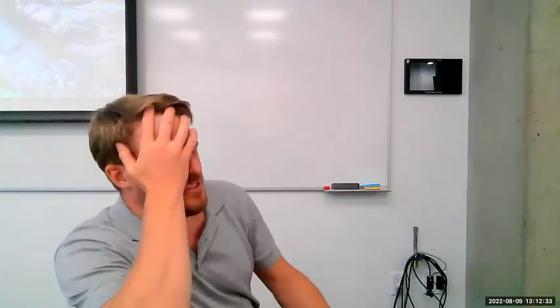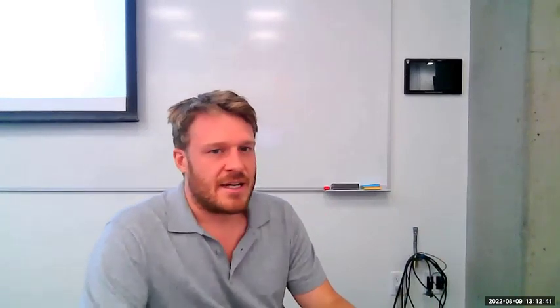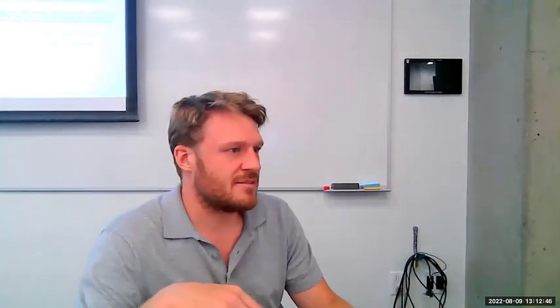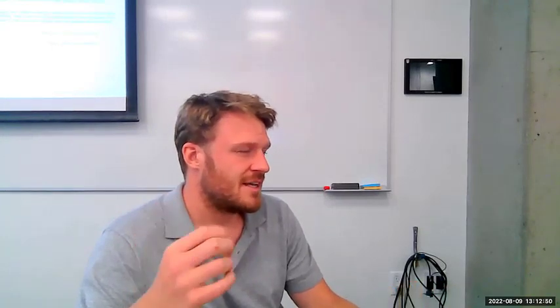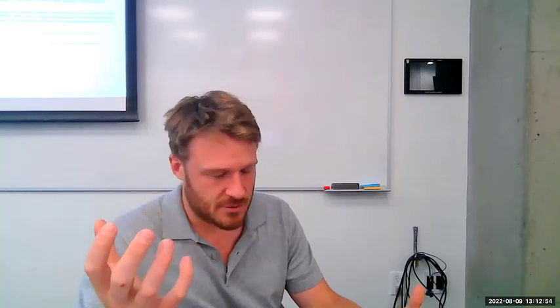I think it all depends on what you're doing. So for instance, if you are looking at FA, so for DTI, if you were to try to compare the entire white matter, you would have so many voxels that you're comparing that you'd have an incredibly difficult multiple comparisons problem.